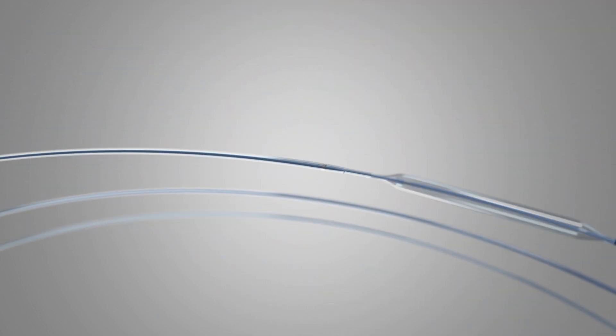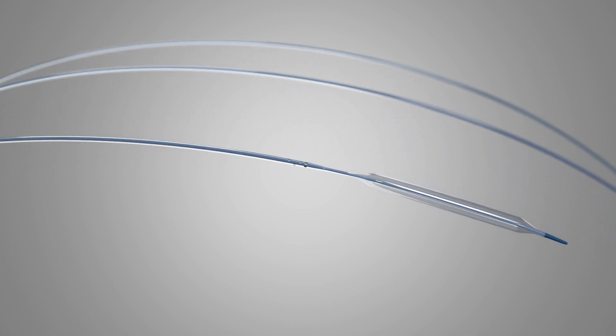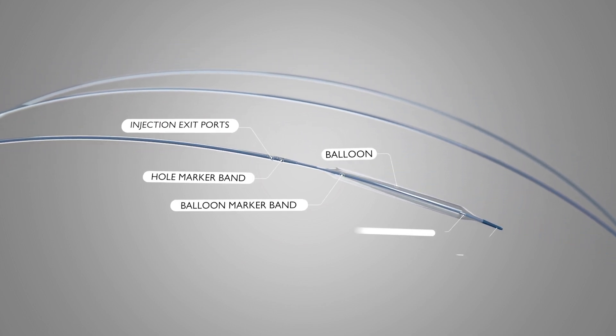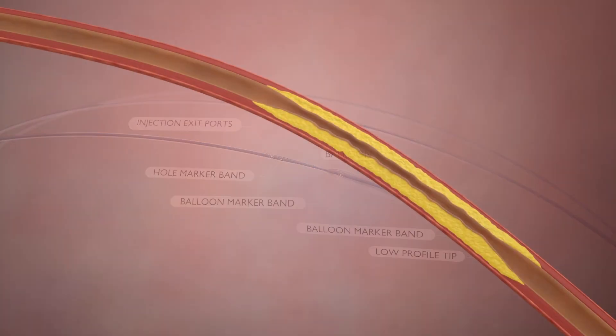The multi-tool catheter is used to select, cross, and dilate arterial lesions, and includes exit ports for injecting radiopaque contrast material or other fluids.